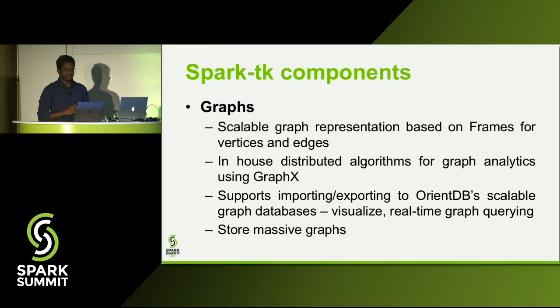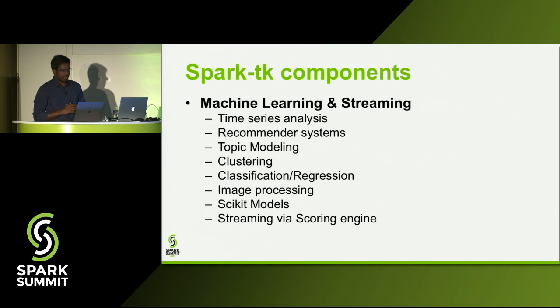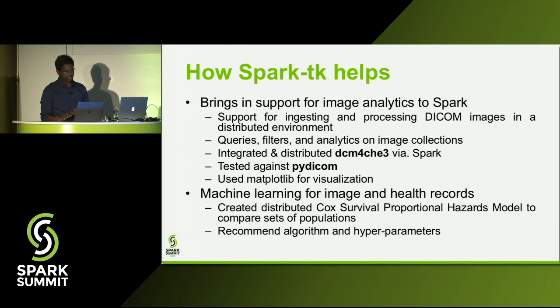And even that has some good algorithms where you can use it. And here we provided some algorithms for machine learning and streaming, like time series analysis, recommender systems, topic modeling, clustering, classification, and regression. So here my main focus is on the image analytics, like what we did specifically for the DICOM image processing in the Spark TK.